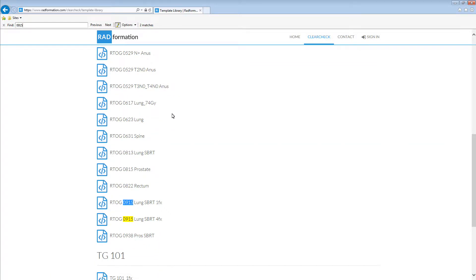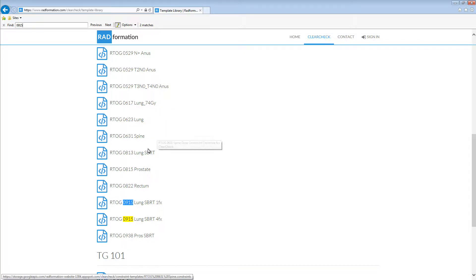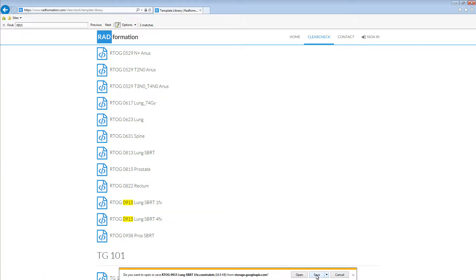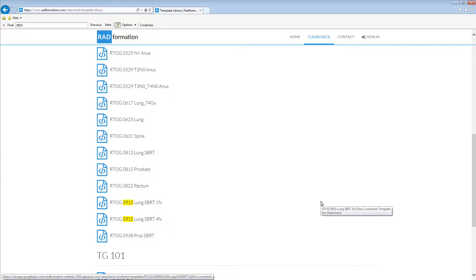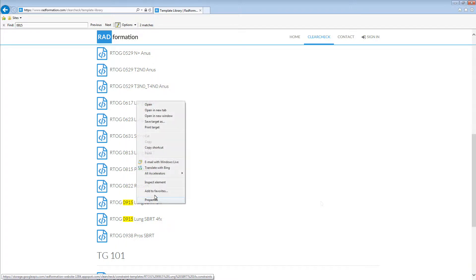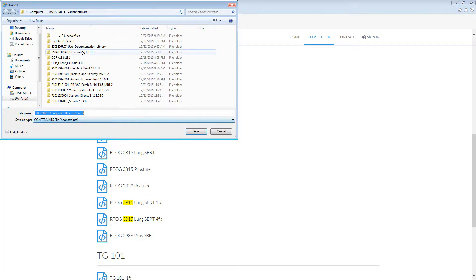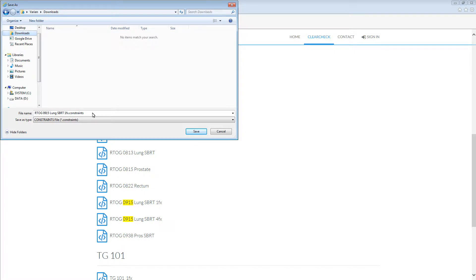Once you find the template you would like to import, simply click on the constraint template. For this example, I'm going to click RTOG 0915, One Fraction Template. Click Save. This will then download the constraint file and place it in your downloads folder on your local computer. If you wish to save the template file in a specific location on your local hard drive, you can instead right-click, then click Save Link As. A file manager will then pop up, allowing you to save this constraint file in any location you would like to save it in. Click Save.